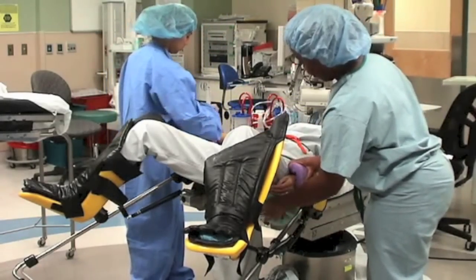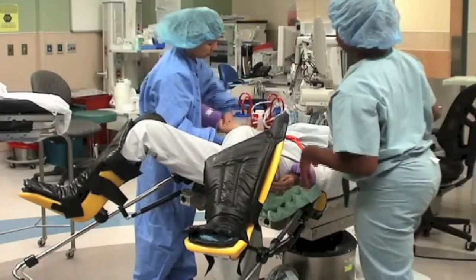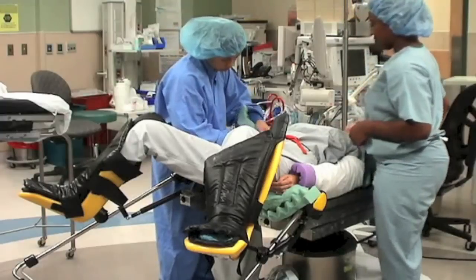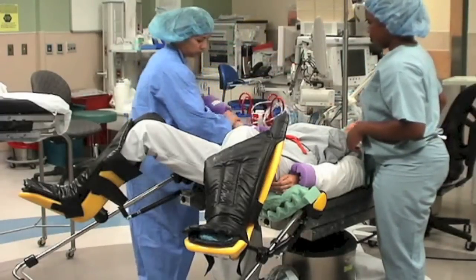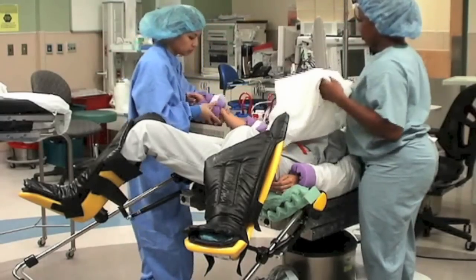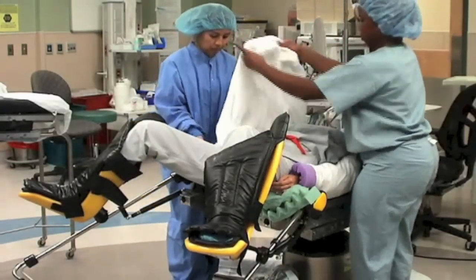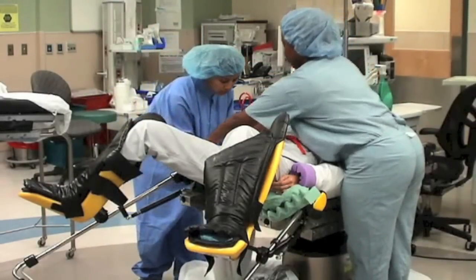Again, if the patient is too wide to have the arms resting on the OR table, then the arm boards can be placed parallel to the OR table to support the tucked arm. Having two people work together to tuck each arm allows for better and more efficient arm tucking.